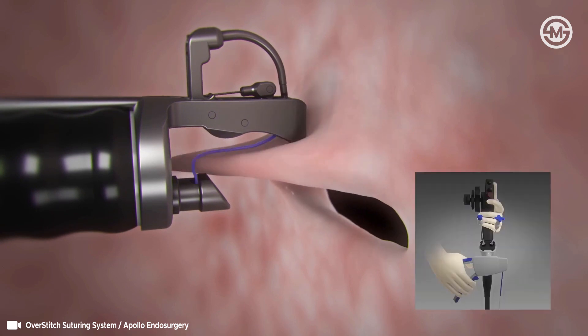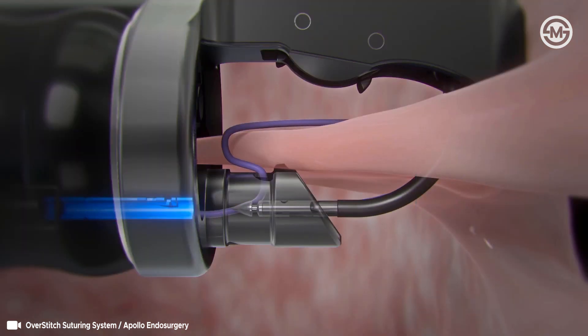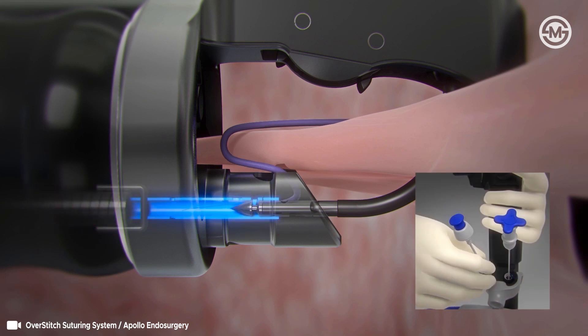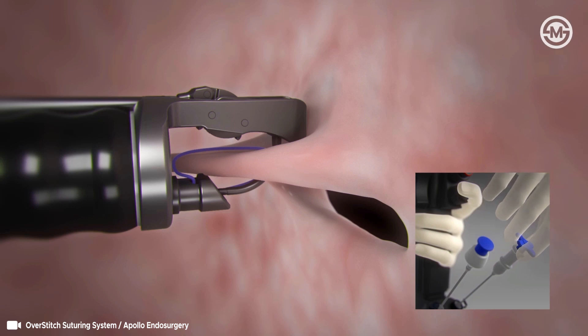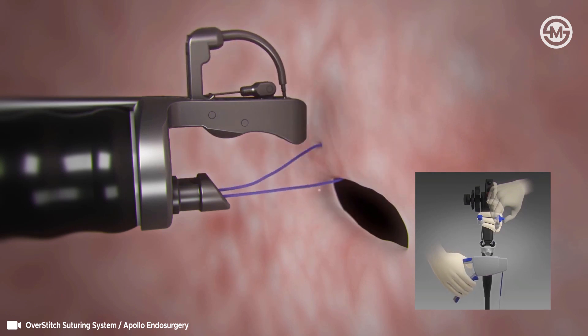Pull tissue until it reaches the scope. Close the needle driver handle to pass the anchor and suture through tissue. Advance the anchor exchange catheter over the anchor until the locking mechanism engages. Without pressing the blue button, pull the anchor exchange catheter back to disengage the anchor from the needle body. Turn the tissue helix counterclockwise to release from the tissue and pull the blue knob to retract the helix.